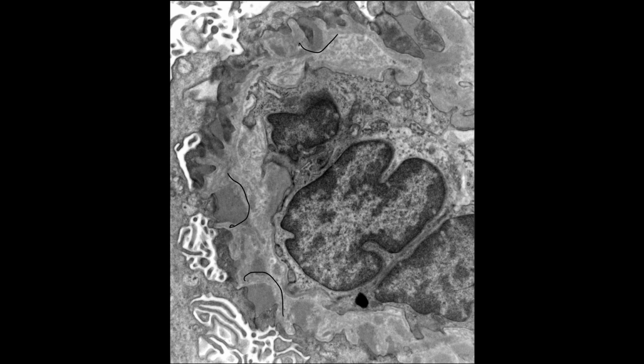So our final diagnosis was that, for one, we have the membranous glomerulopathy, which was PLA2R positive. We also had a collapsing glomerulopathy. And then thirdly, we had immune complex deposits within the tubular basement membranes. And that opened up quite a wide differential, such as autoimmune disorders, drugs, infections such as HIV, viral hepatitis. So we actually had 3 diagnoses in this case.